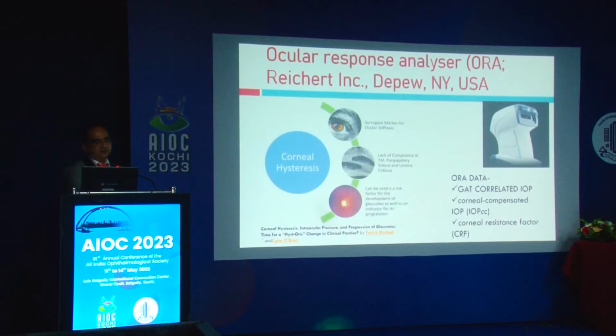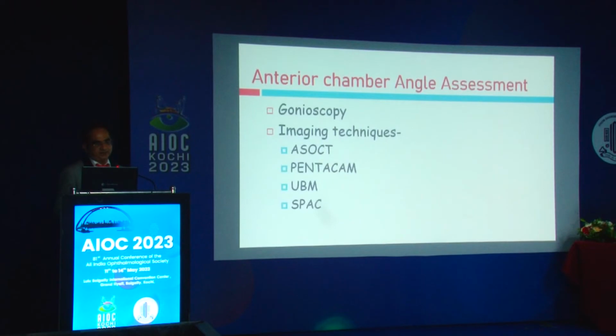Next one is the ocular response analyzer. It is based on corneal hysteresis and can be used as a risk factor for development and progression of glaucoma. This ORA gives data about the GAT correlated IOP, corneal compensated IOP, and corneal resistance factor.